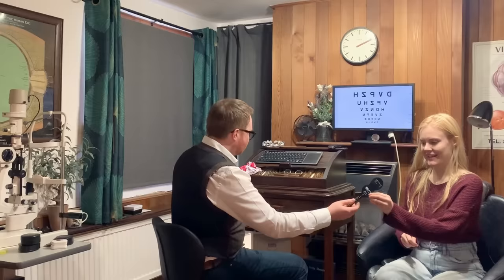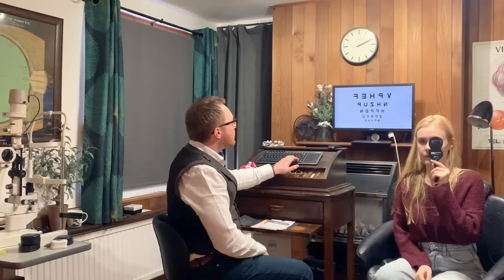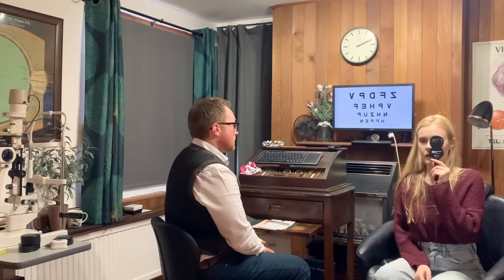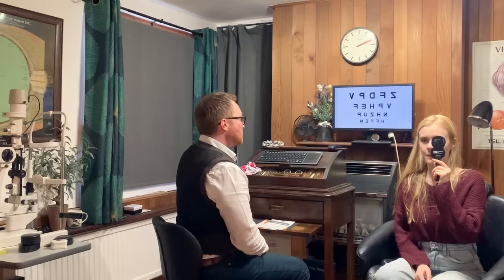So I'll get you to cover up your left eye and let's get rid of those smaller ones. They'll probably be a bit fuzzy. What would you say is the smallest line you can get just with this eye? Probably the second from the bottom. Okay, yeah, do you want to read that one for me? N-H-Z-U-P. Brilliant. Excellent. Do you want to have a go at the bottom one or is it a bit fuzzy?